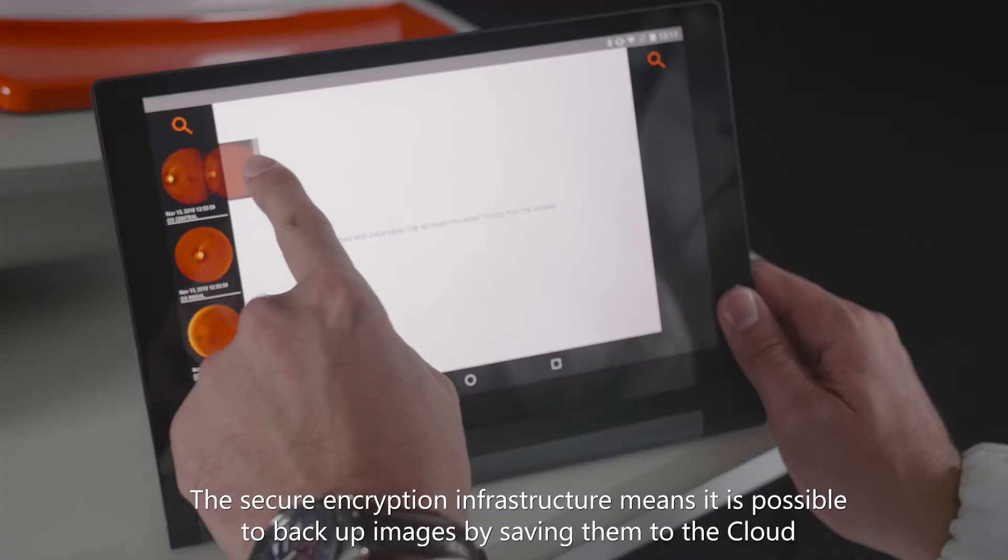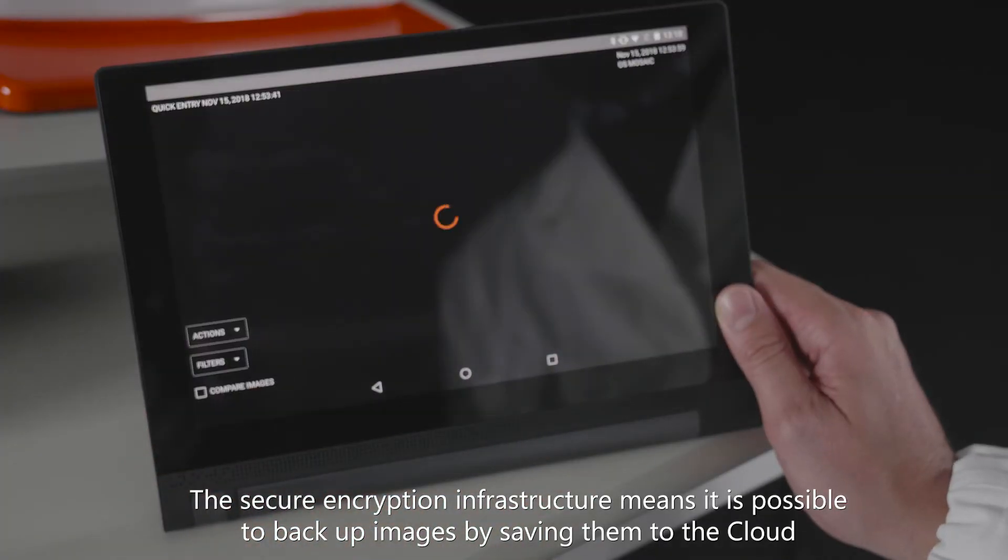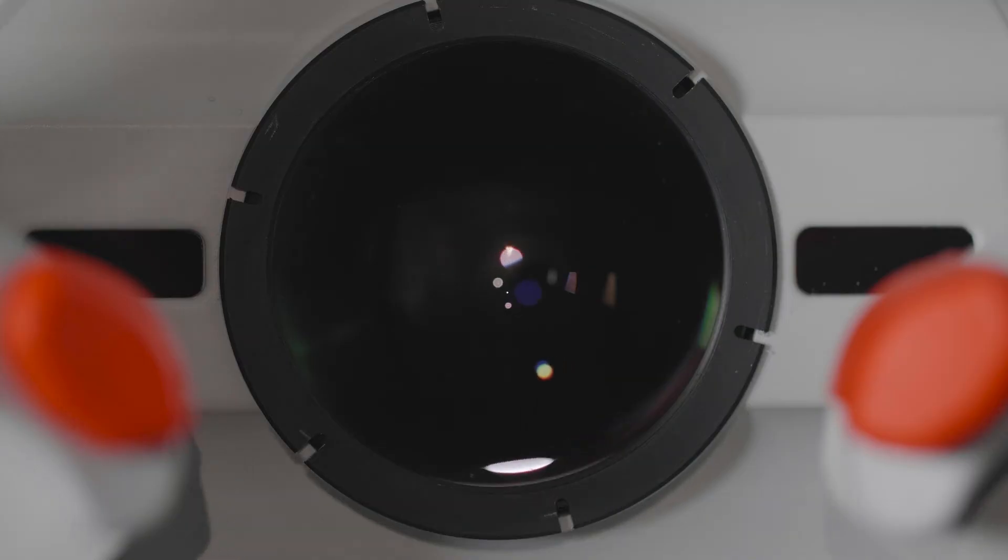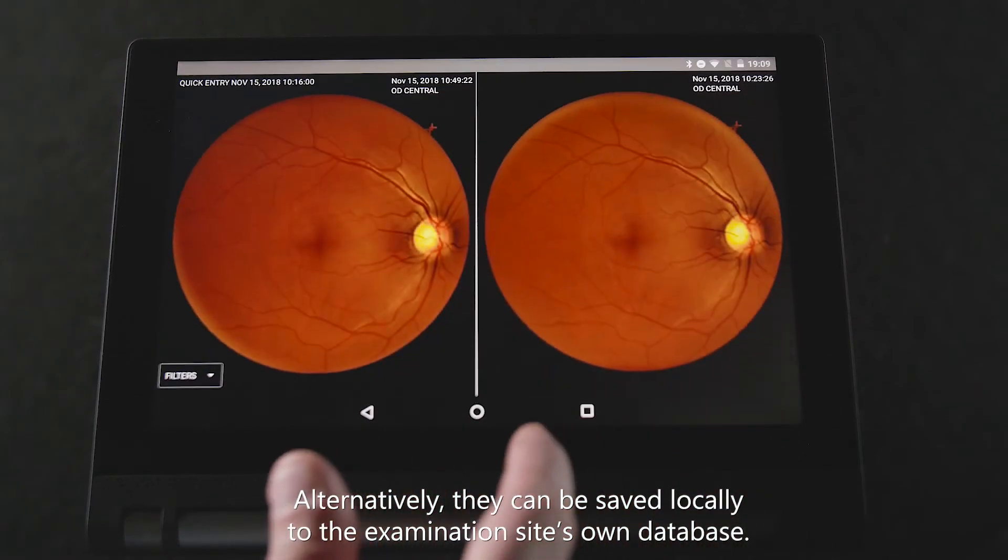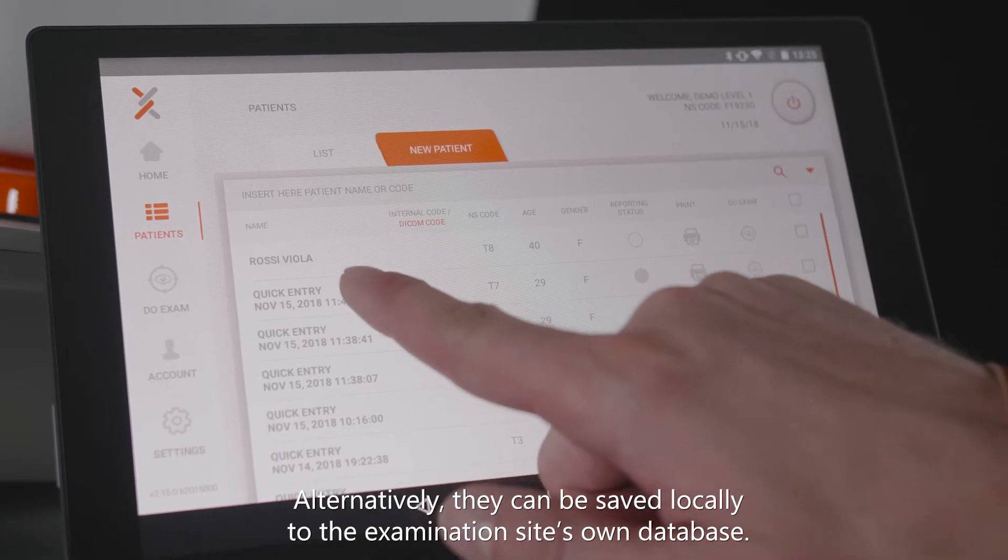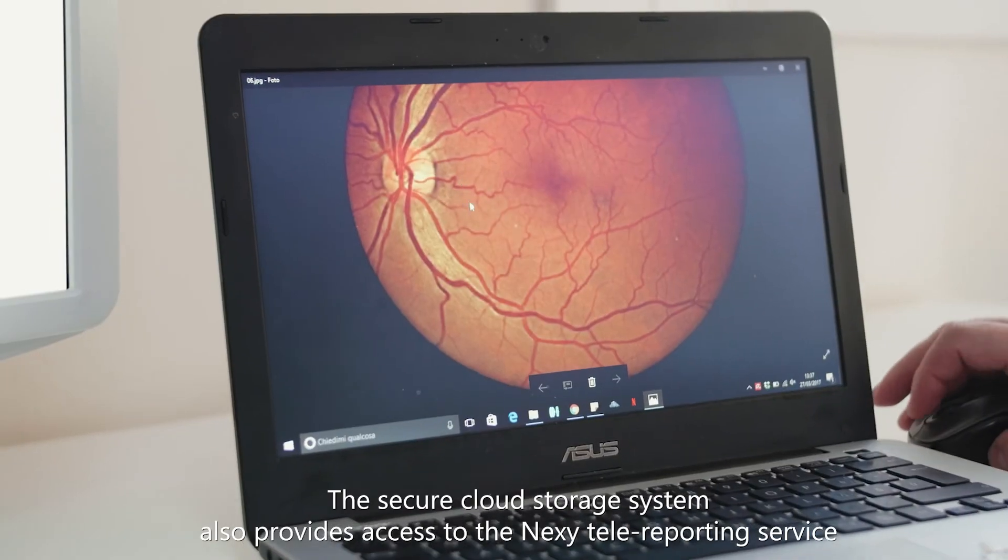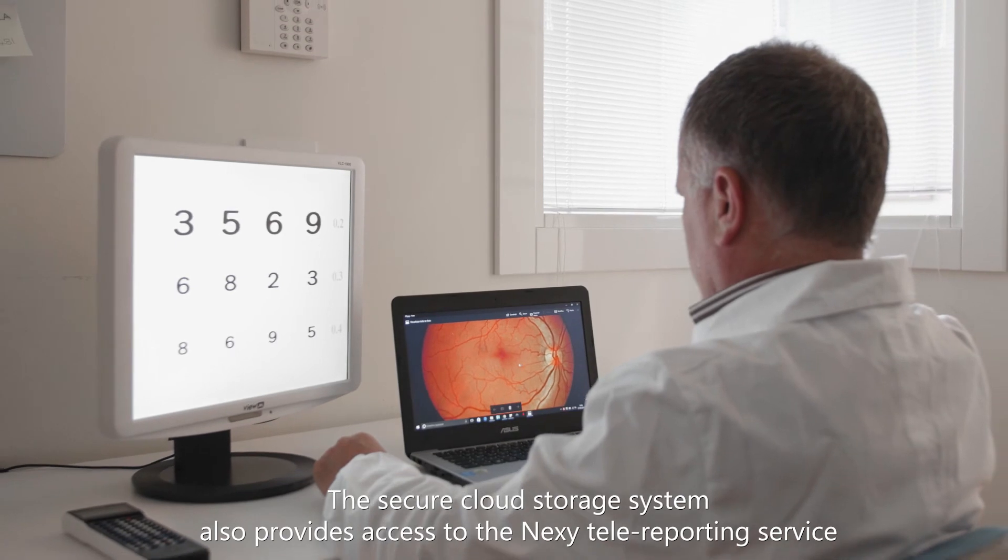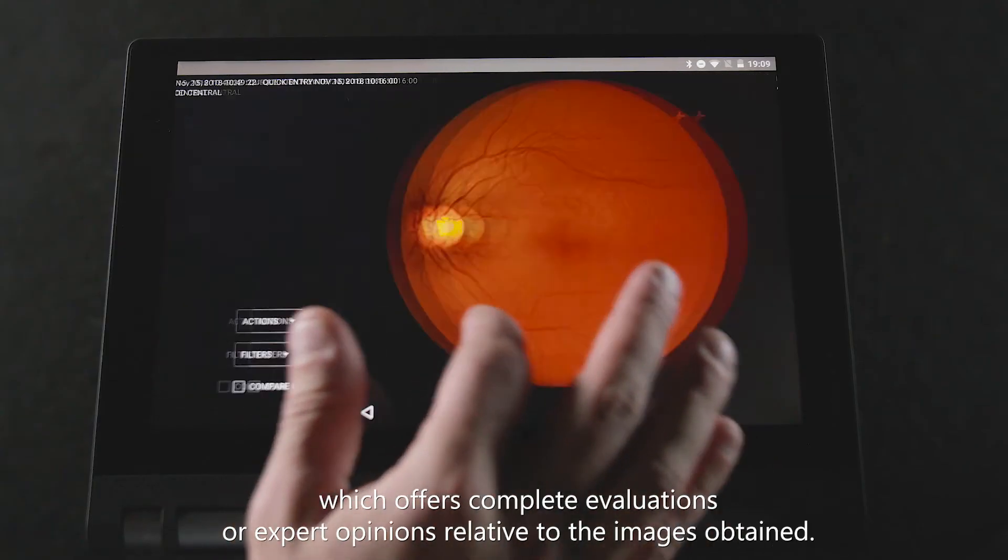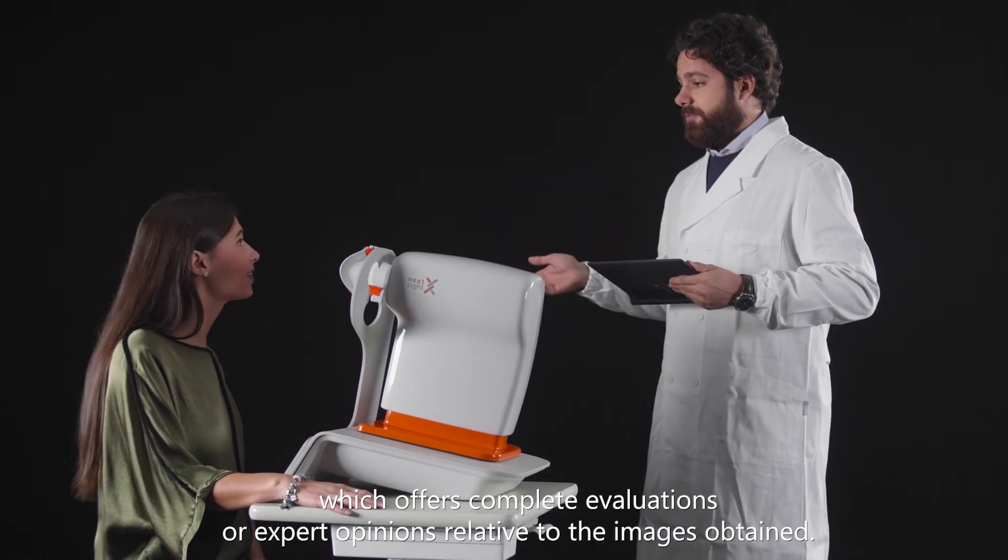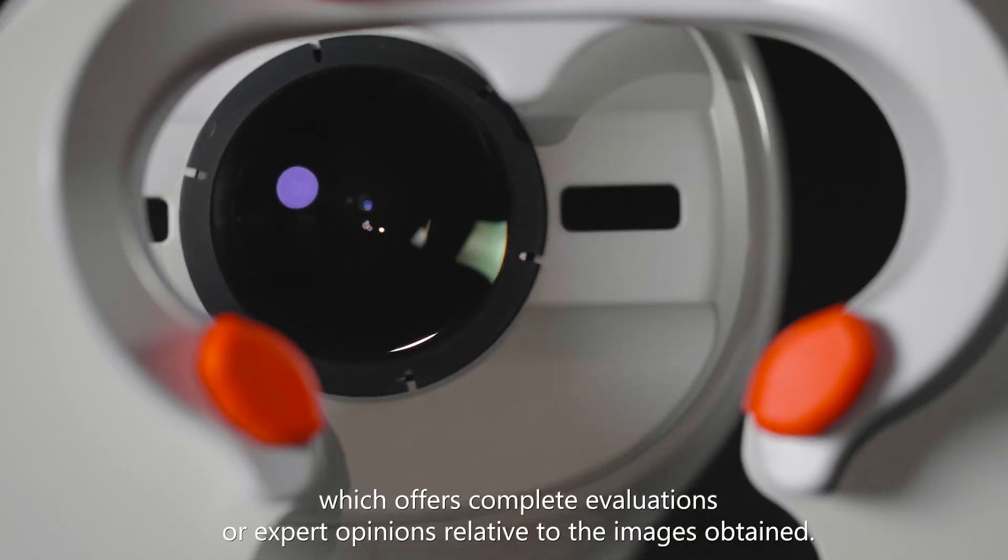The secure encryption infrastructure means it is possible to back up images by saving them to the cloud. Alternatively, they can be saved locally to the examination site's own database. The secure cloud storage system also provides access to the Nexi tele-reporting service, which offers complete evaluations or expert opinions relative to the images obtained.